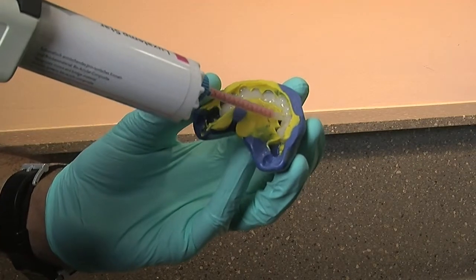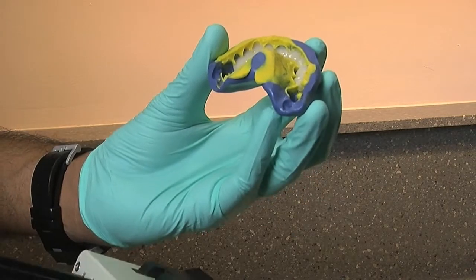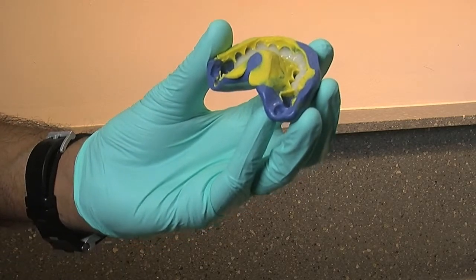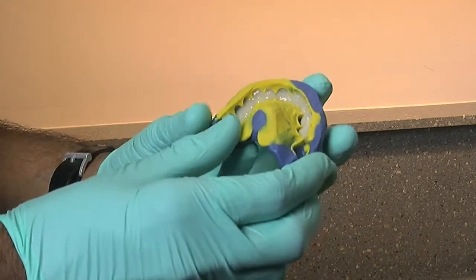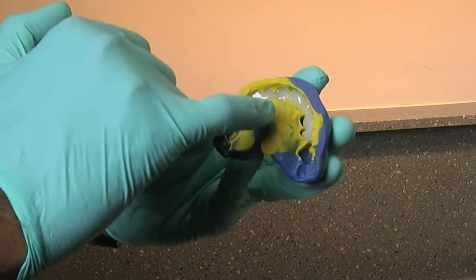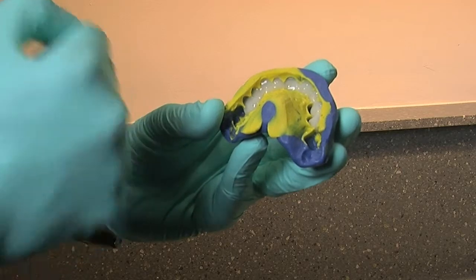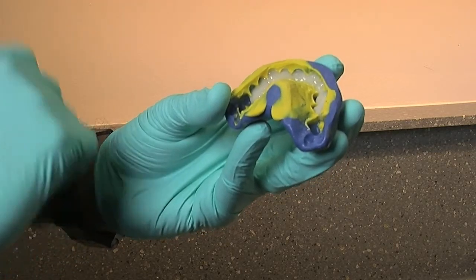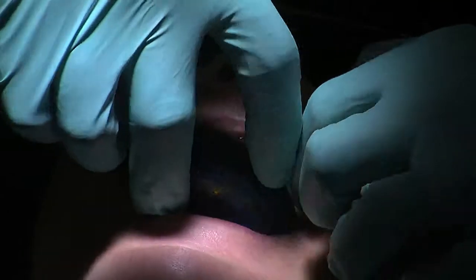That's really it. It's fully loaded. This would then be introduced into the mouth and seated very firmly. And after 2.5-3 minutes, you take it out. Notice we've got good palatal reference against the palate, so that we've got a very positive stop and you get no distortion anteriorly, so the flash is very thin. And then I'm going to bring it back into the mouth.